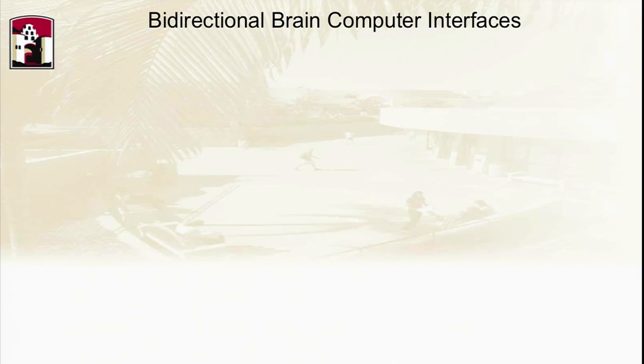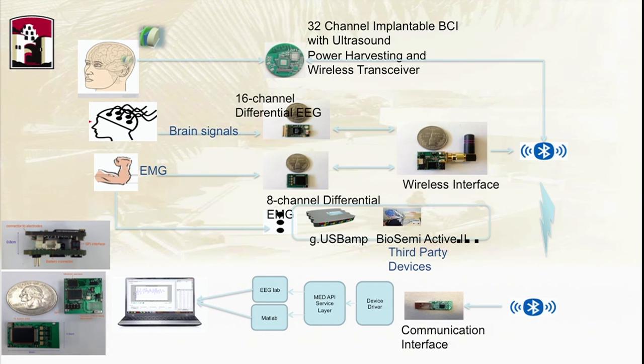Nevertheless, this system did not have any stimulation capability or the ultrasonic charger capability. So when our research shifted a little bit, we decided that, okay, now we have a system which can record from the muscles, which can record the EEG signals, the intention, the concentration levels, and we can control simple things by measuring the level of concentration and designing games around it, and our students are hacking these systems to do such things.